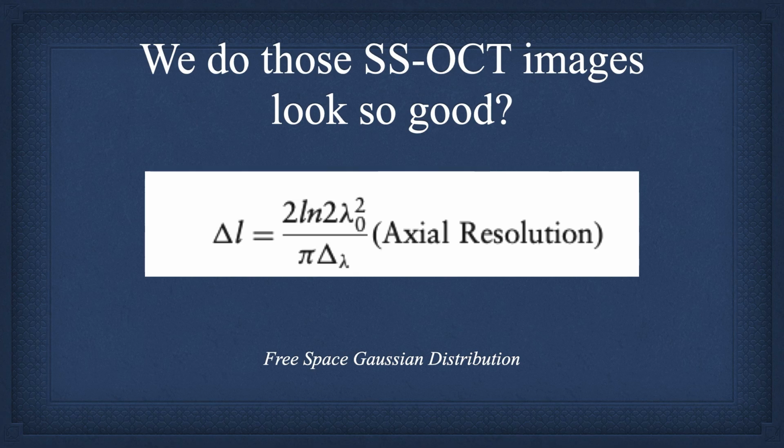So why is it that if I go to my local optometrist, he or she has a time domain system, and it's got crappy images, and you see these swept source systems with great images? They're better, in my opinion. It's all down to better engineering, because this may or may not be the reason, but let me just give you, for those who weren't involved in OCT from early on, some history.